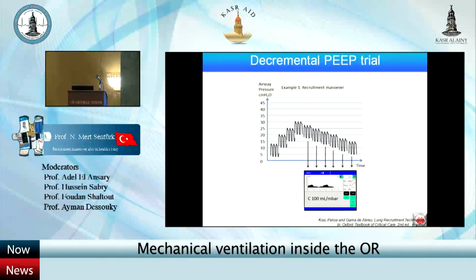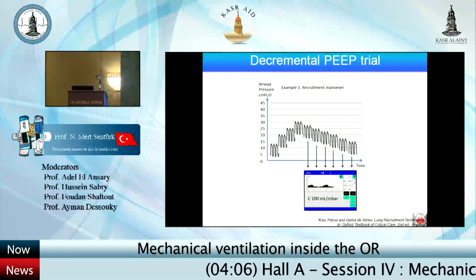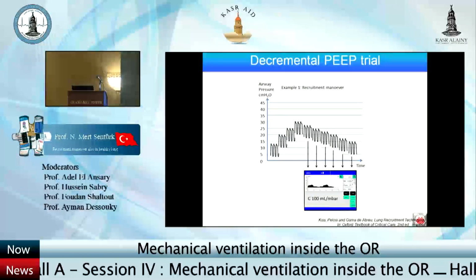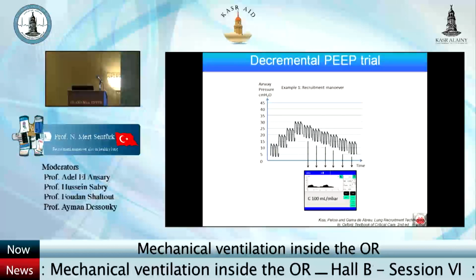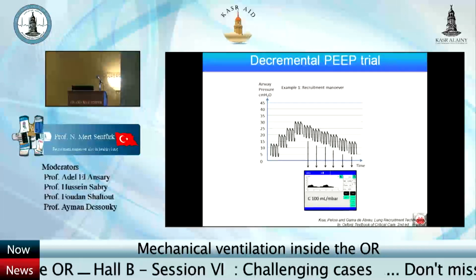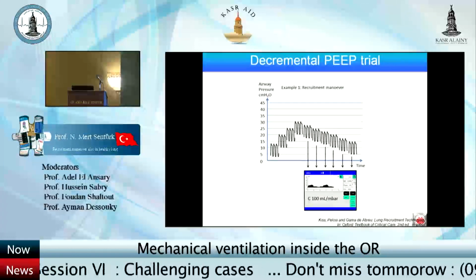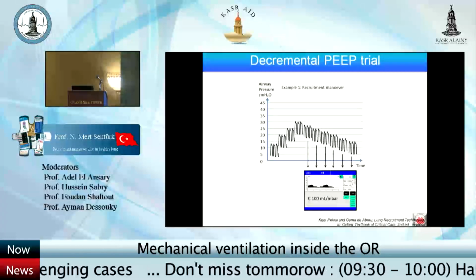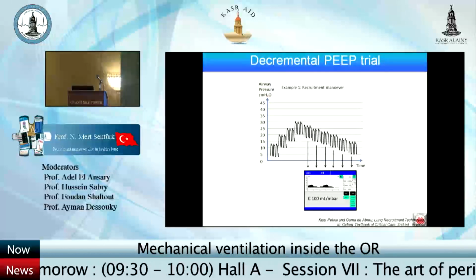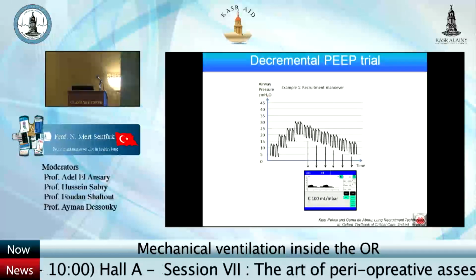That means with the same driving pressure, I would have the best tidal volume. That would mean the best compliance. And afterwards, if I drop below the ideal PEEP, the compliance will decrease again, and then I would have such a curve. If I have a decrease in compliance, you can stop your PEEP trial. And that PEEP, let's say here, that PEEP would be your best.